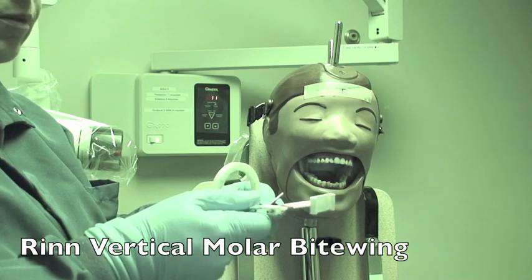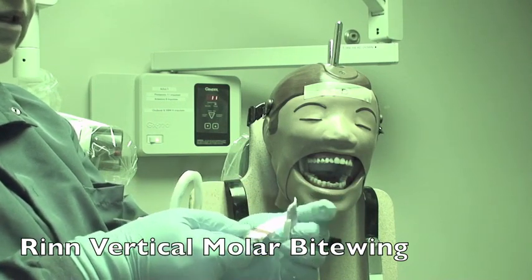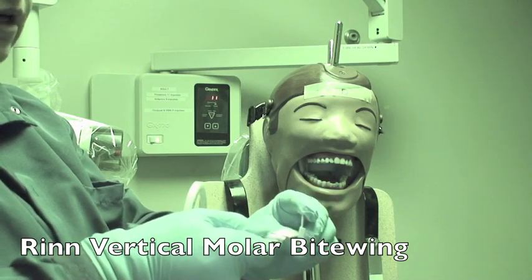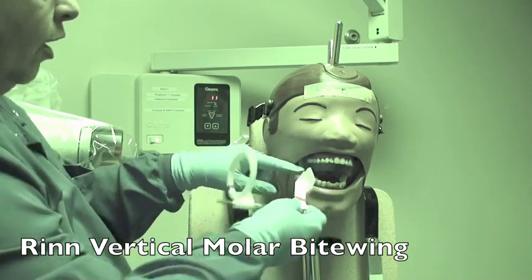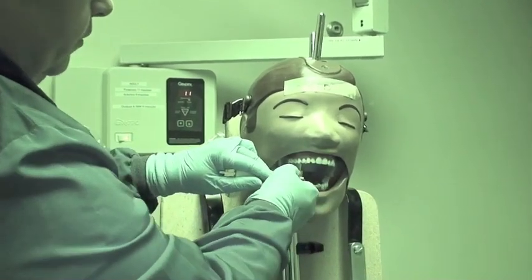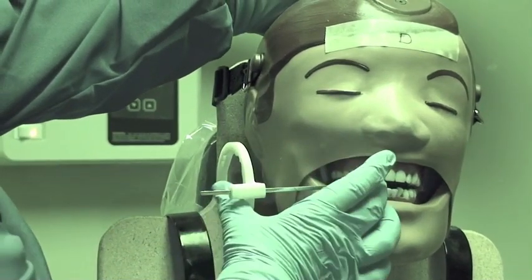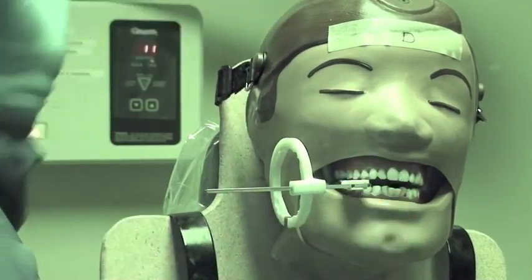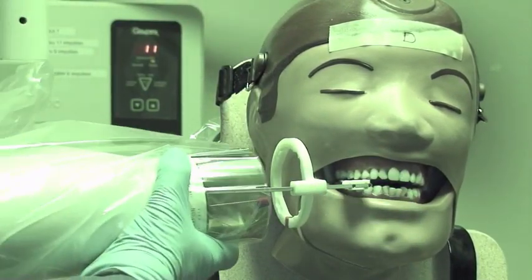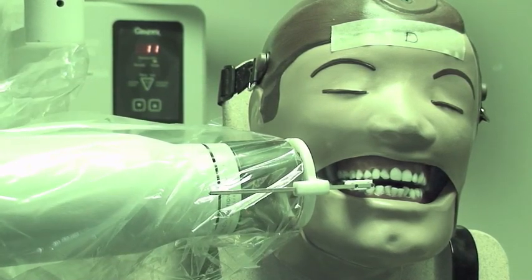When doing the vertical bite-wing, put the vertical bite-wing in opposite of the ring. Center the film on the bite block. Because of the size of the teeth, start at the distal of the last erupted molar and come forward to get two to three millimeters beyond the last molar. Then have them close and line up the PID parallel to the ring.